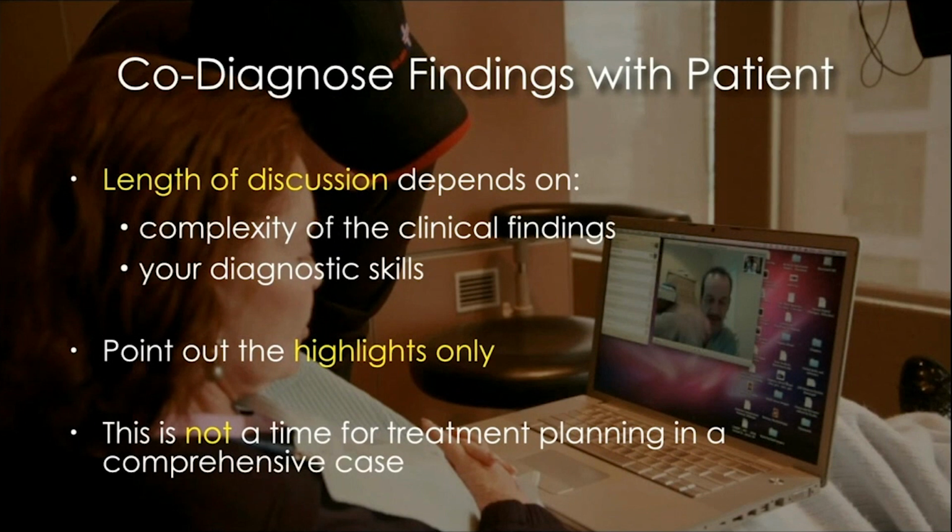When I've collected the data, I'll spend some time, and I always do that, and I'll discuss the photos and the images and the scans with the patient. I really just point out the highlights. It's not time for me to plan the case, because the patient often says, well, what are you planning to do? And I usually say, well, I need some time to study your case if it's more complex, or sometimes I honestly say, I don't know what I'm doing yet.